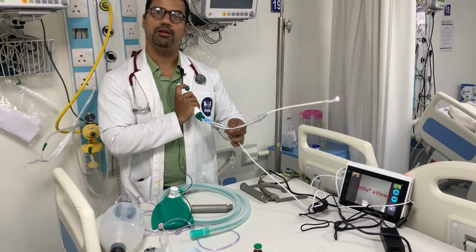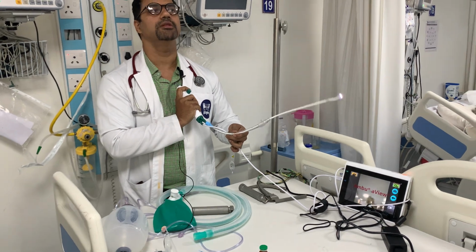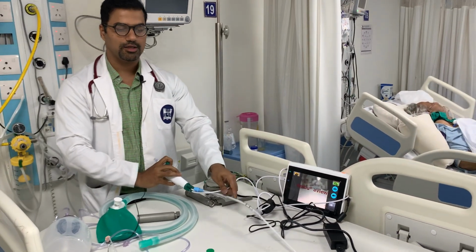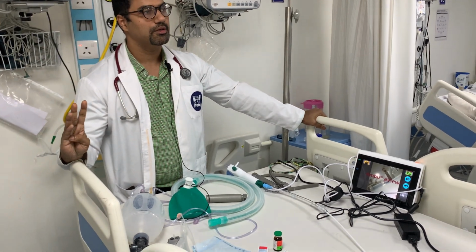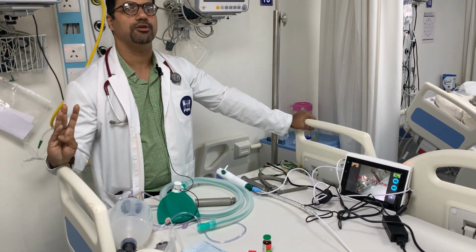Even this can fail, there will be times when even this can fail. So what are the other options that you can have? Apart from this, you can go for cricothyroidotomy. Okay, or the last option is tracheostomy.